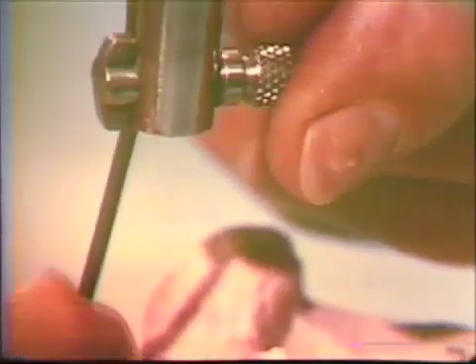The contour of the abutment tooth is evaluated for retentive areas. The survey tool is then removed and a carbon marker inserted to record the height of contour on the abutment tooth.